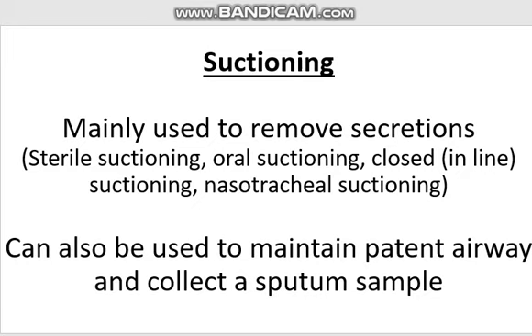Suctioning is mainly used to remove secretions. This is done with sterile suctioning, oral suctioning, closed or inline suctioning and nasotracheal suctioning. It can also be used to maintain a patent airway and collect a sputum sample.